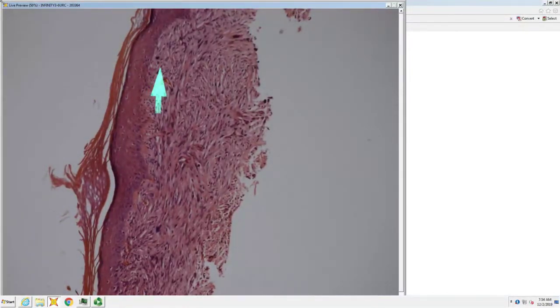So it is an atypical spindle cell tumor slammed up against the epidermis. Squames. So you'd want to get something like a P40 or P63 or keratin 903 for squamous cell carcinoma spindled, an S100 or SOX10 for the possibility of spindled melanoma, a Caldesmon for leiomyosarcoma, and if everything's negative, it's probably an AFX, atypical fibroxanthoma.